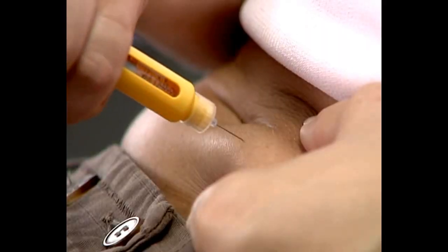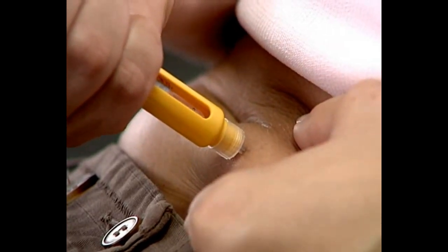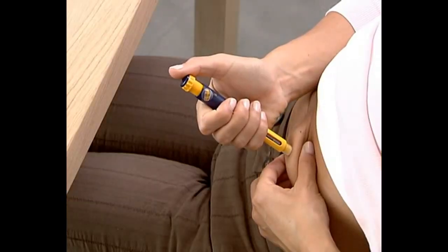Pinch the skin a little. With the other hand, insert the needle at an angle of approximately 90 degrees into the skin's surface.